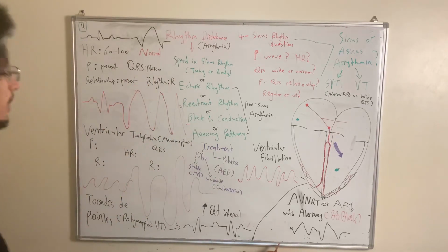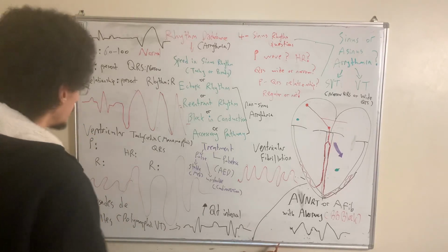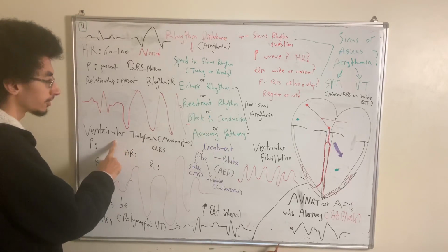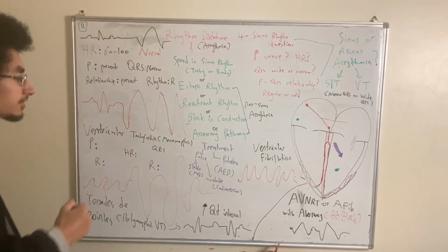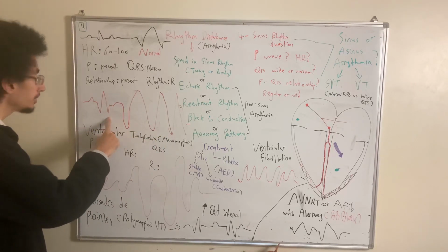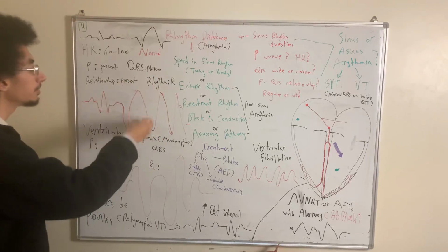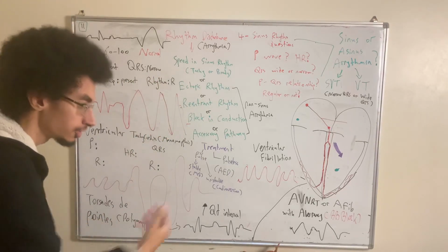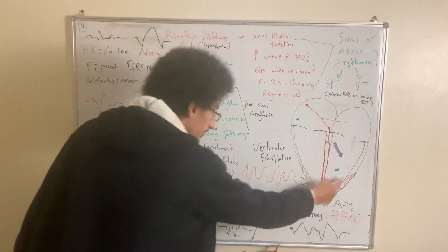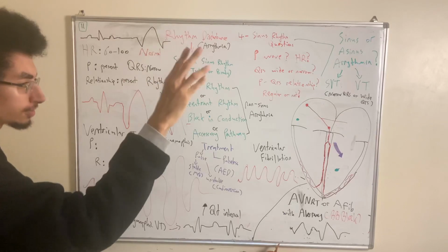Now, let's talk about what ventricular tachycardia even means. From the name, you have tachycardia, but this tachycardia arises from the ventricles. What does that mean again? That means that after a normal sinus beat, you see a couple of premature ventricular contractions, which, if you recall from the previous video, means you have an ectopic source coming from the ventricular pacemaker cells, generating an action potential at a 30 to 45 rate.